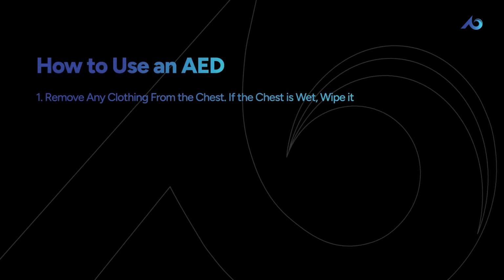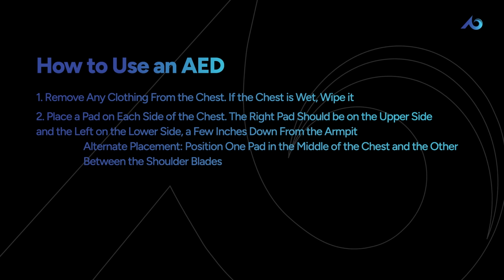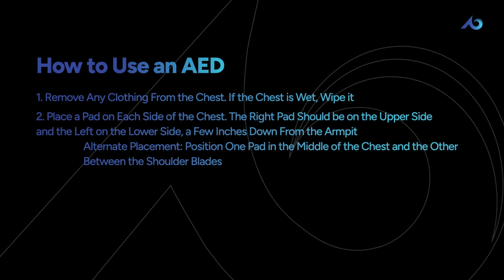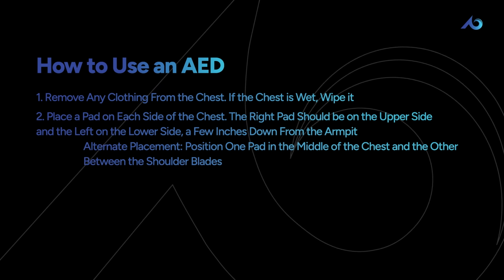Remove any clothing from the chest. If the chest is wet, wipe it. Place a pad on each side of the chest. The right pad should be on the upper side and the left on the lower side, a few inches down from the armpit. If you think the pads might touch, try this alternate placement. Position one pad in the middle of the chest and the other on the back between the shoulder blades.